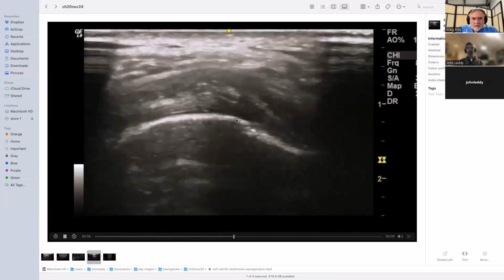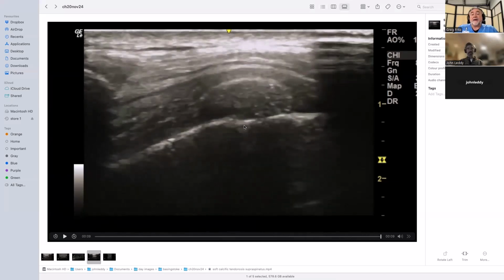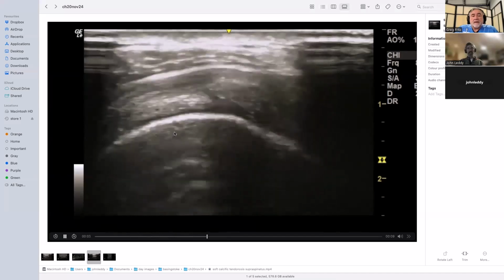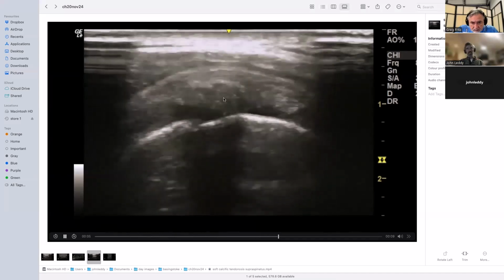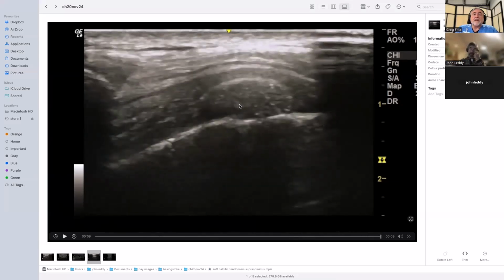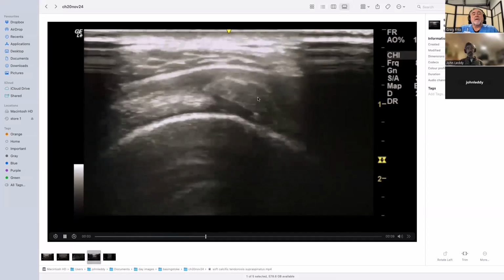Right. So this you know all about. This is, I would say, supraspinatus calcific, the CPPD type thing. Yes, calcific tendinosis, I would describe that as. And I would say it was late stage. So if I stuck a needle in that, I would be optimistic about getting something out. I can't remember. I don't think I might have put a needle into this, but not much came out, I don't think.